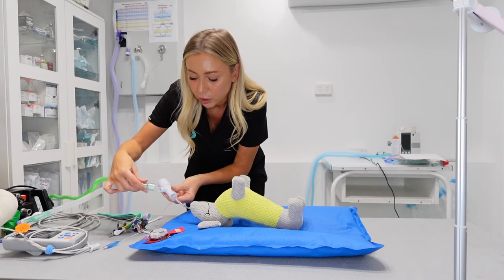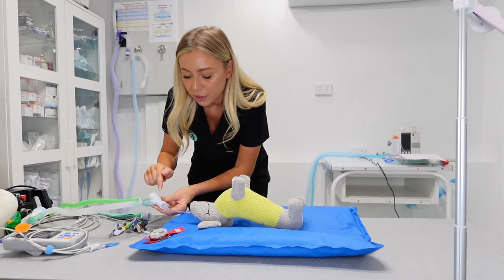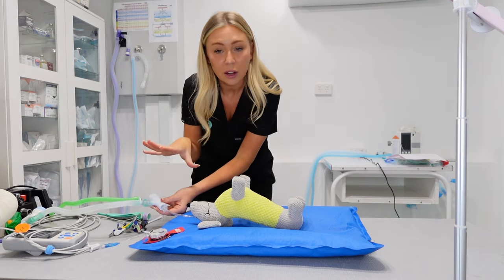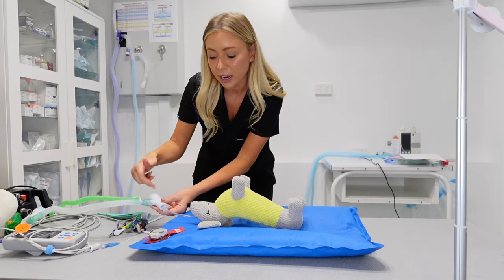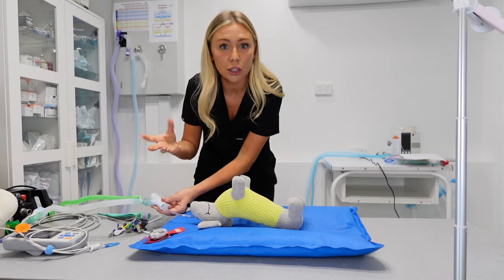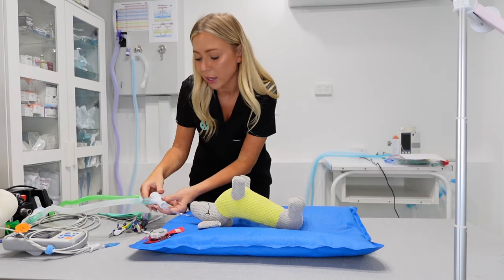And this end to your breathing tube. Every time a breath is made, it will beep. If there is a lack of breathing — if the patient has stopped breathing and it hasn't detected any breaths for a long time — it will alert. This will probably go off in a minute and you can get an example.